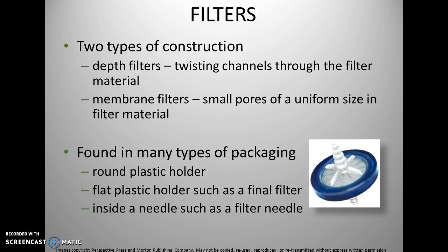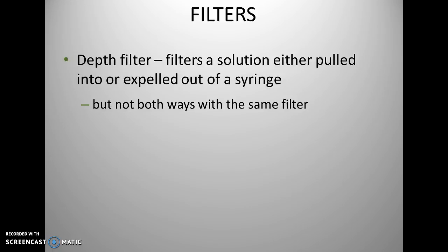Okay, so a membrane filter, similar to the one above right here, is often placed between the syringe and the needle before the medication is introduced into an LVP, a large volume parenteral, or SVP, which is a small volume parenteral.